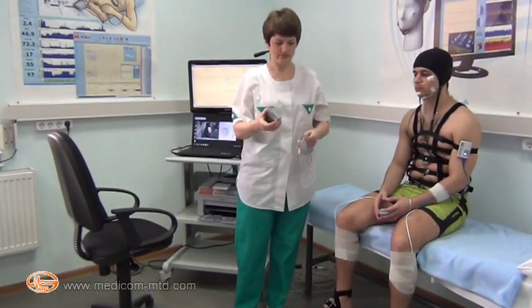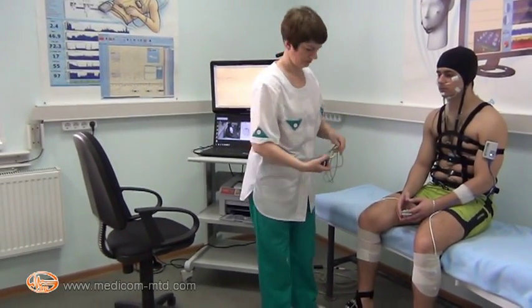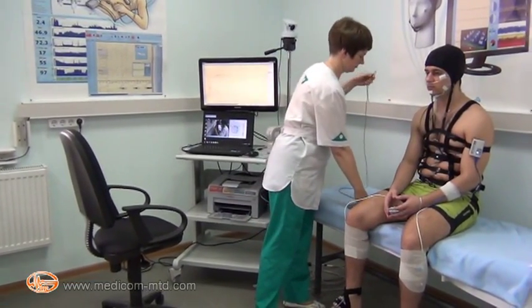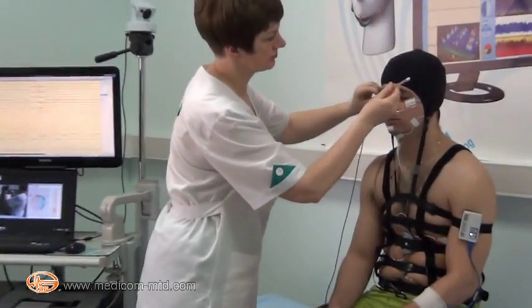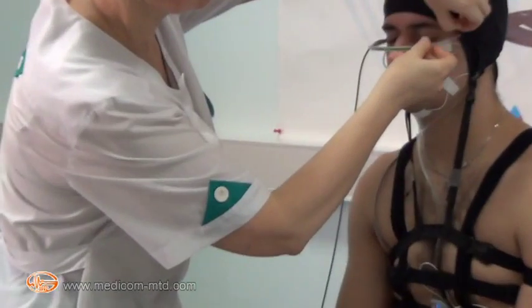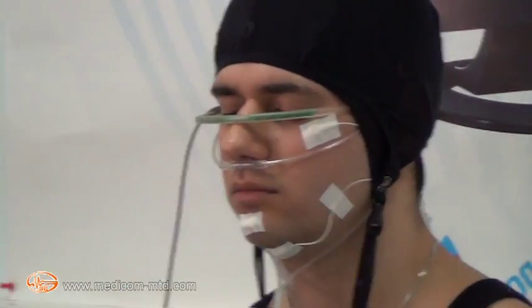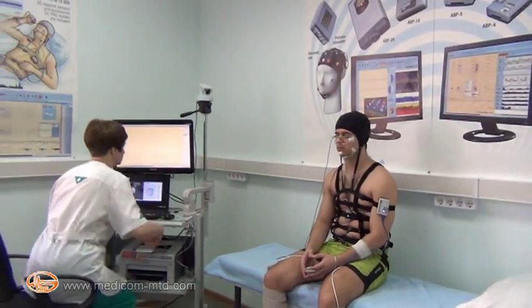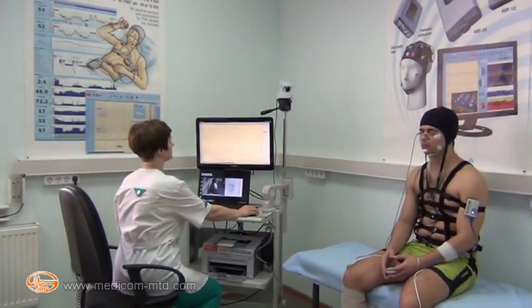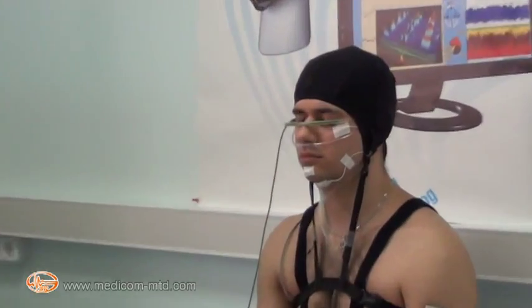Photostimulation can also be carried out using an LED flash tube connected to the stimulator. The tube is placed in front of the patient's eyes and fixed by the cap. Photostimulation is then performed with different frequencies according to the scenario.